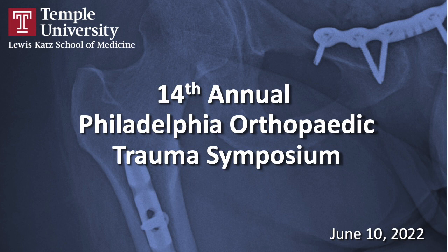I'd probably go back to that paper that described what they did. So I believe the answer would be to take off the frame, debride the pin sites, wash everything out, and put them in a splint. You could also convert to a different frame in a different location, trying to bypass where you're going to operate. If it was a frame only on the tibia and you needed this frame for whatever reason, you could extend up to the femur, down to the ankle, do something different to allow your pin sites to seal off and be sterile or quasi-sterile prior to operating.